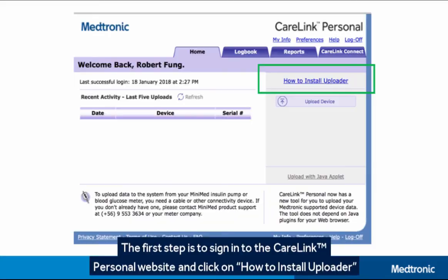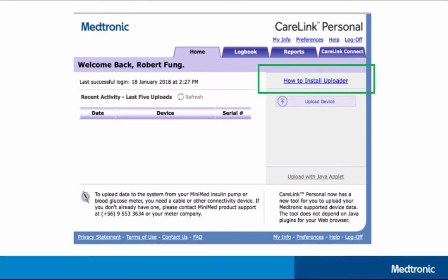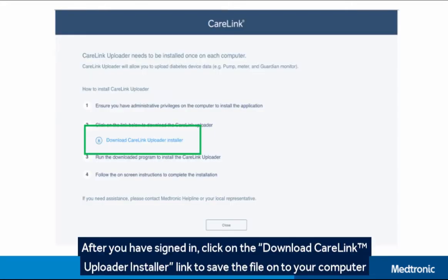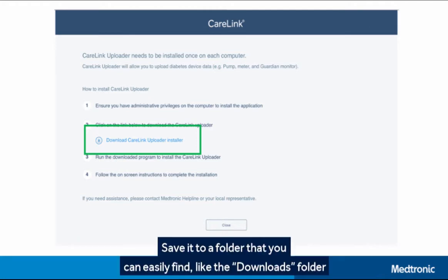The first step is to sign in to the CareLink Personal website and click on How to Install Uploader. After you have signed in, click on the Download CareLink Uploader Installer link to save the file onto your computer. Save to a folder that you can easily find, like the Downloads folder.